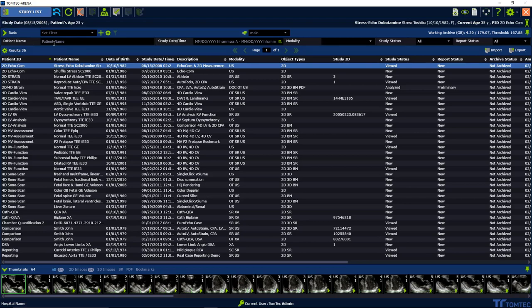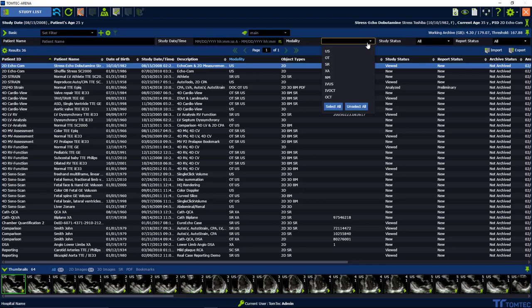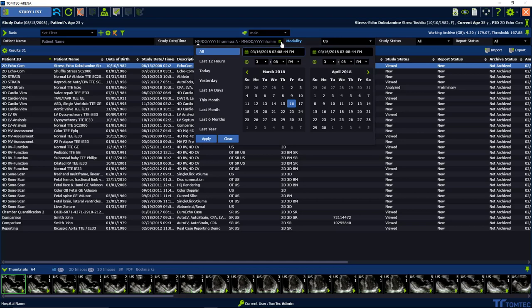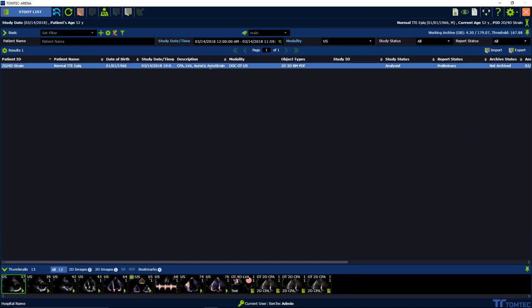You can type in something manually, choose from the drop-downs or from the study date and time functionality, and you can also combine filter functionalities like study date and modality. See the results immediately.